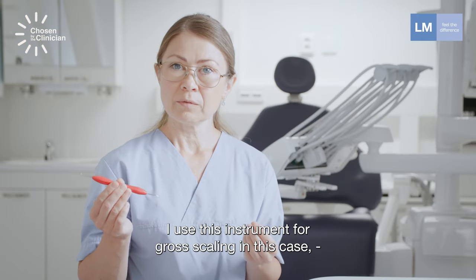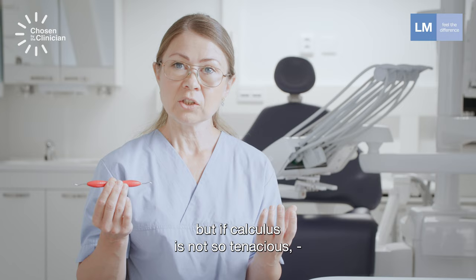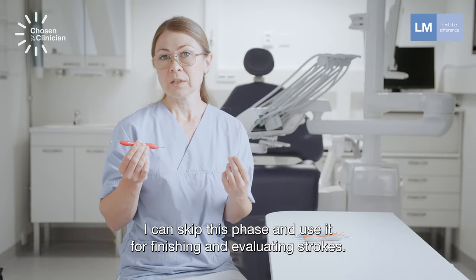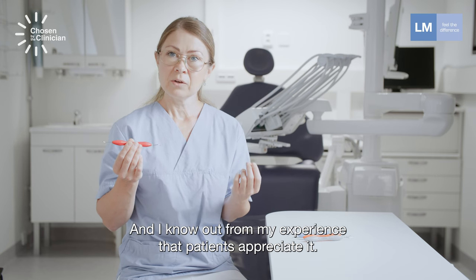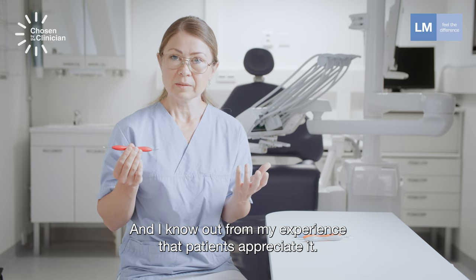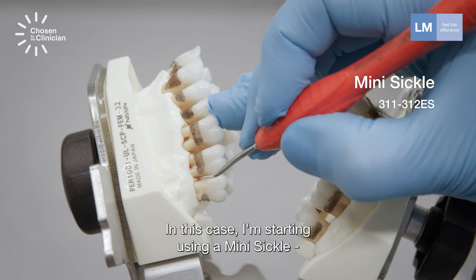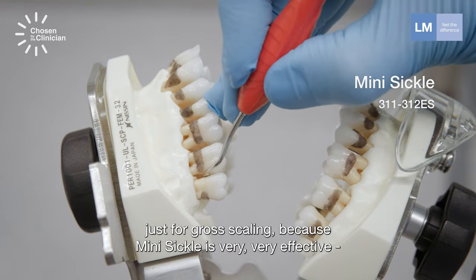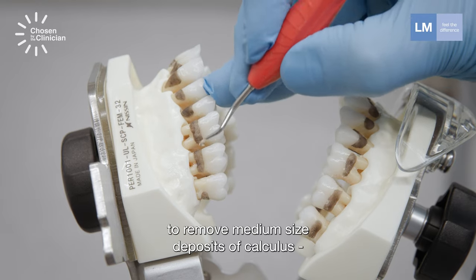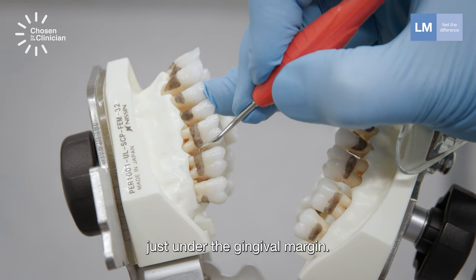The mini sickle is one of the best instruments, especially in combination with universal or area-specific curettes. I use this instrument for gross scaling in this case, but if calculus is not so thick, I can skip this phase and use it for finishing and evaluating strokes. From my experience, patients appreciate it. In this case, I'm starting with the mini sickle just for gross scaling.